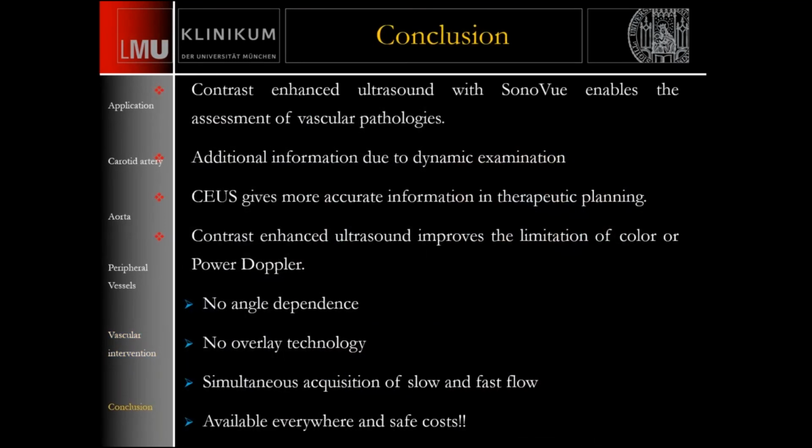What are the take-home points for you? So probably I could show you that sonography is very helpful for most of the vascular pathologies. It gives you additional information regarding perfusion, and it has no dependence on the scanning angle and is no overlaying technique. Also, there's the option to detect slow and fast flow at the same time.